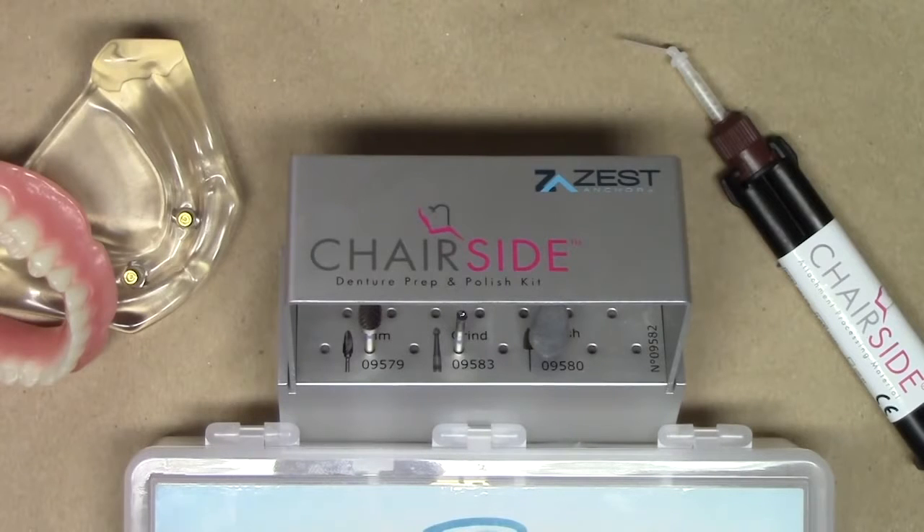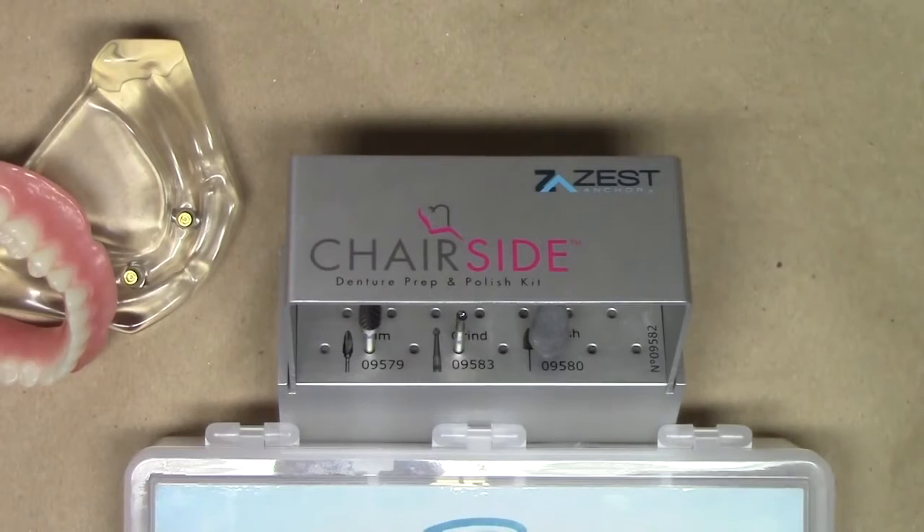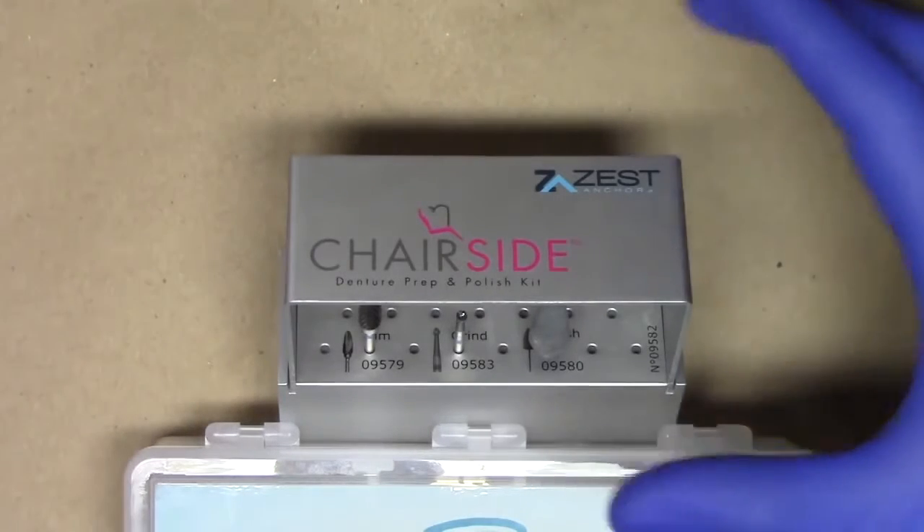The purpose of this video is to describe an exciting new product called the Zest Chairside Denture Prep and Polish Kit. In this technique demonstration, I'm going to be utilizing this burr block to process two locator denture caps into my complete denture, utilizing the burr block and the Zest Chairside attachment processing materials.